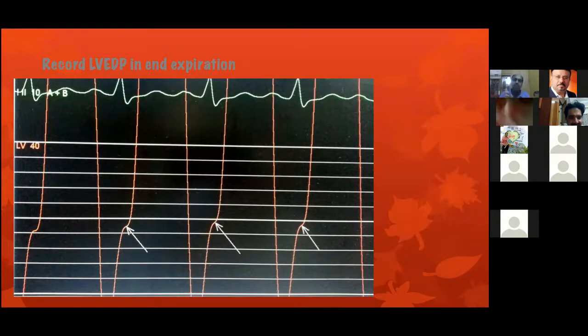With left-sided events, the adverse effect is significant pulmonary venous hypertension, whereas with right-sided events, the adverse effect is systemic venous hypertension. Compared to pulmonary venous hypertension, systemic venous hypertension is very, very benign, and hence not too much stress is given on the hemodynamics of simultaneous RV and PA trace, or simultaneous RA and RV trace.